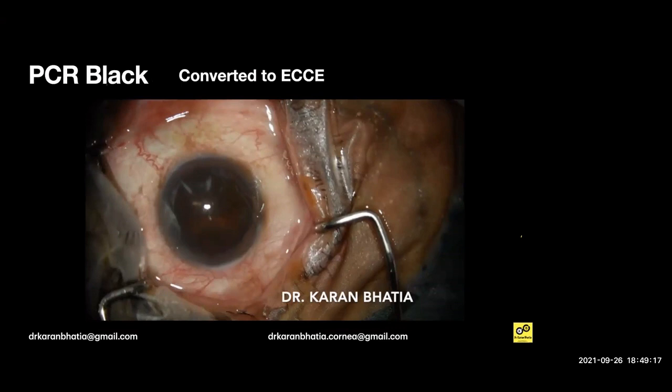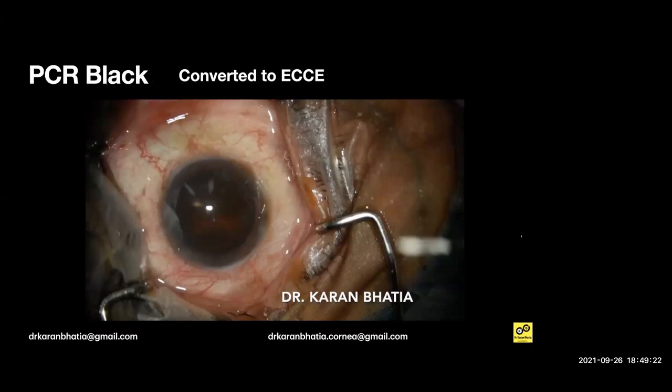In this case after vitrectomy, the IOL was placed in the bag — an Alcon IQ lens. If it's in the sulcus, you should put a 3-piece IOL and not a single-piece IOL. Then the wound was sutured, with sutures to be removed at one month.